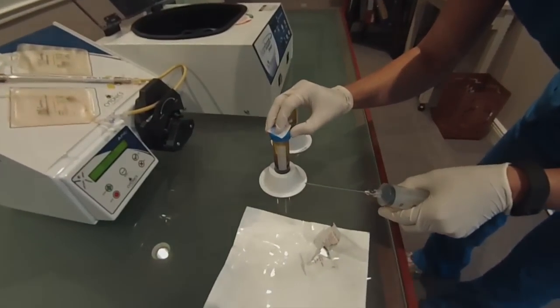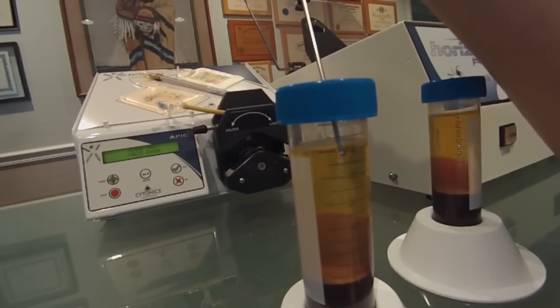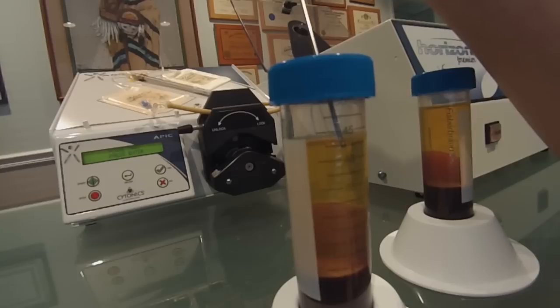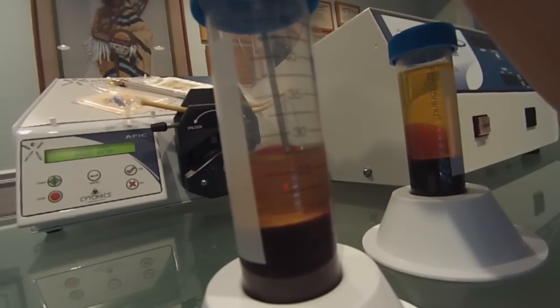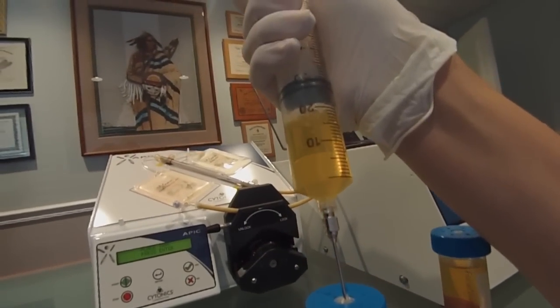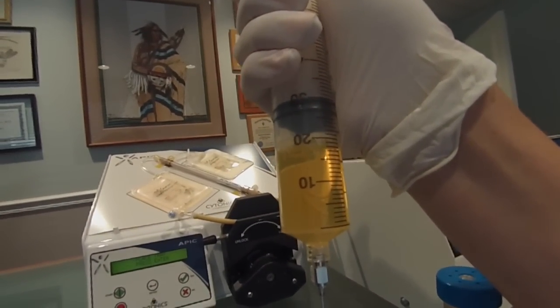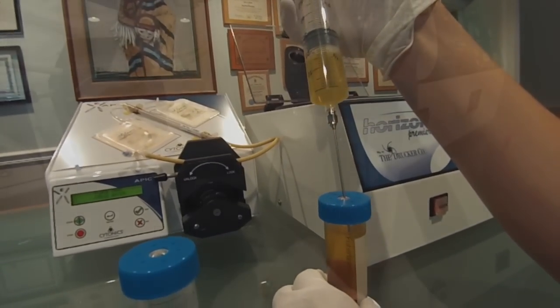Remove the sheath cap from the needle and discard. Alcohol wipe the septum of each centrifuge tube and carefully insert the plasma collection needle into the tube. Slowly collect plasma from the top down. Collect 15 to 20 cc's of plasma, being careful not to disturb the buffy coat. Ensure that the plasma collection needle is at least two graduations above the buffy coat at all times.